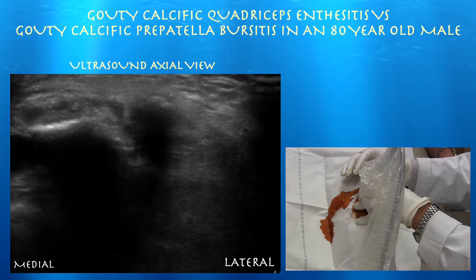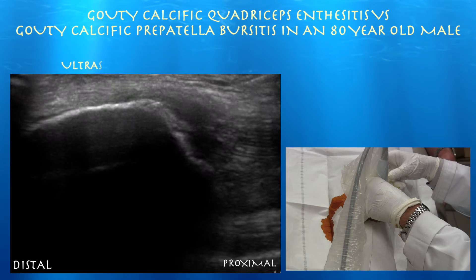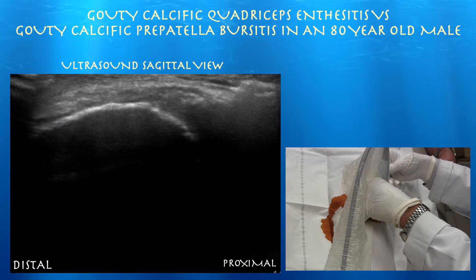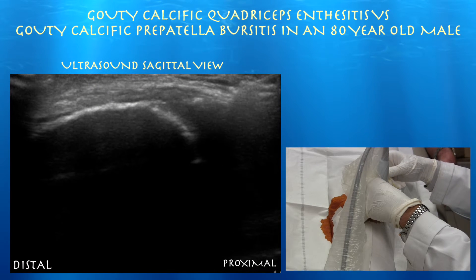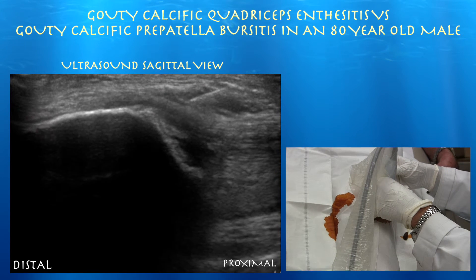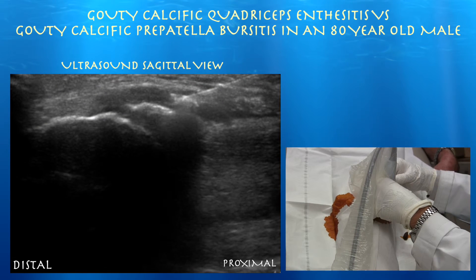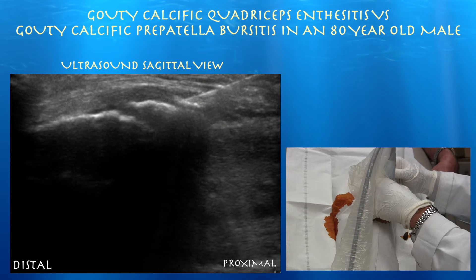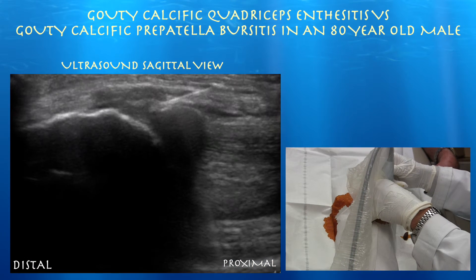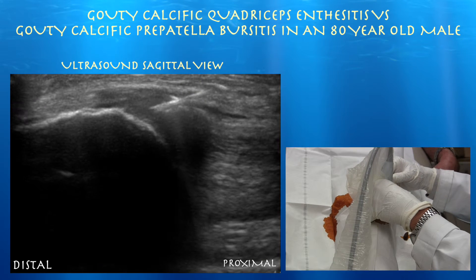I think this is really an enthesitis — a gouty enthesitis. Just injecting lidocaine superficially right on top of it. Now we're going in and out of that calcium deposit. Part of the rationale for mechanically breaking up these deposits is that it makes it easier for the body to resorb the calcium by increasing the surface area. That's why I'm doing this — also, it may cause a little bleeding here and stimulate some healing and hopefully pain control.